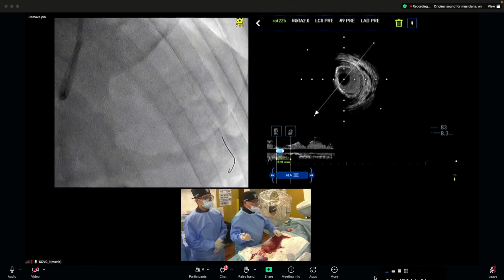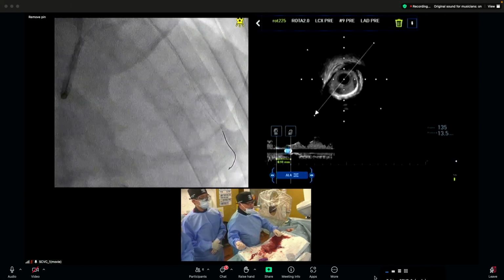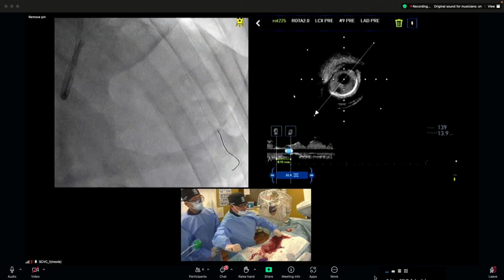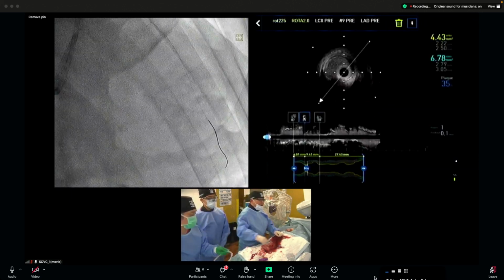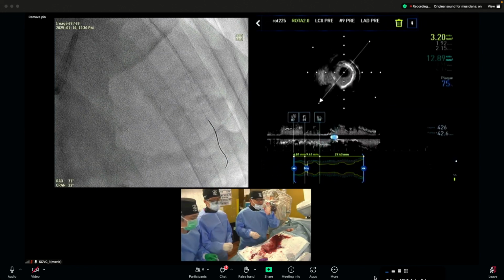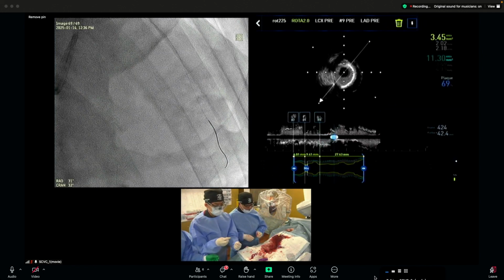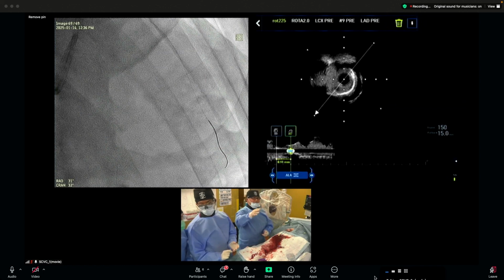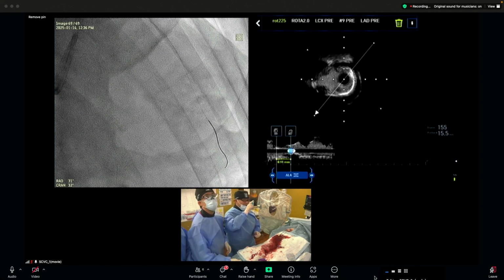So if you choose more than 2.0, you almost always don't need more than 200,000. And of course, if you use less than a 1.75 bar, sometimes you need 200,000 or more, because the surface speed is much different. So rotablation performance gets better with a larger bar.